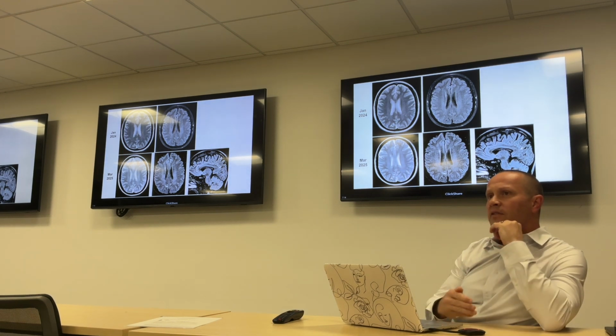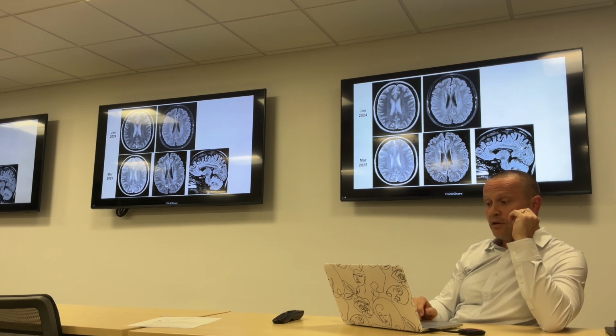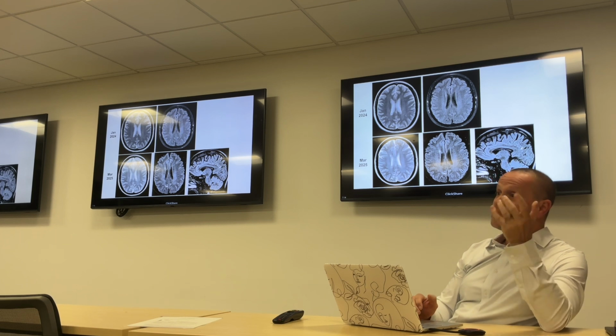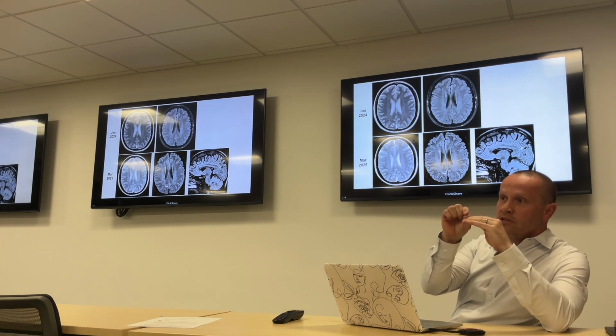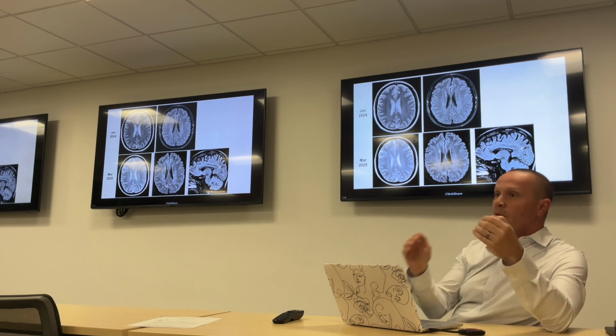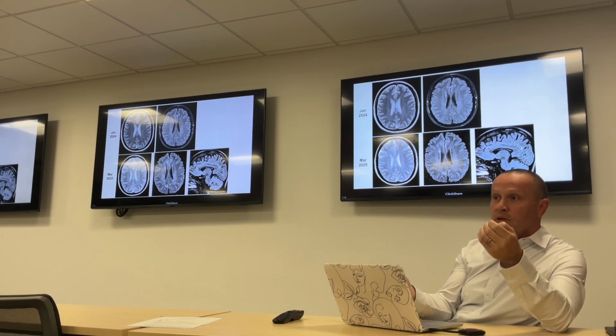It's one of those things you get used to seeing over time, and it's a very valid observation. It does absolutely look brighter here, and it catches your eye quite a bit more easily. And sometimes that can be tricky because if a lesion happens to be right between two slices, you may miss it completely. Or it might show up on one study, and then on the next study, it's a lot less conspicuous.